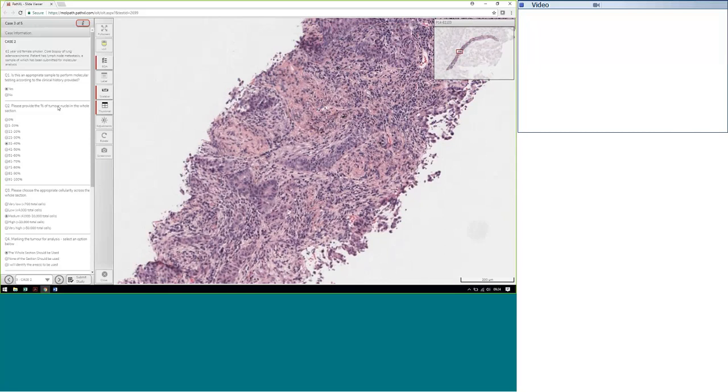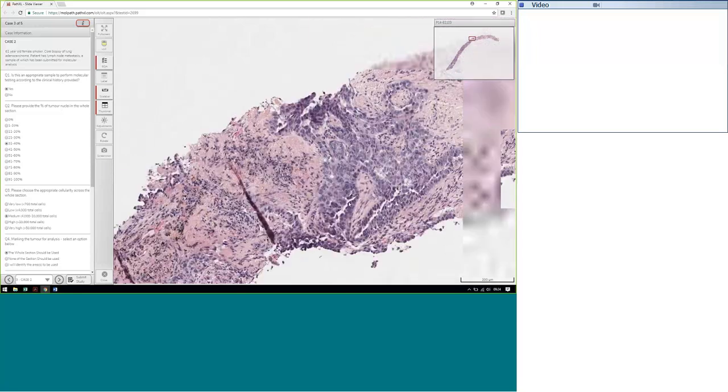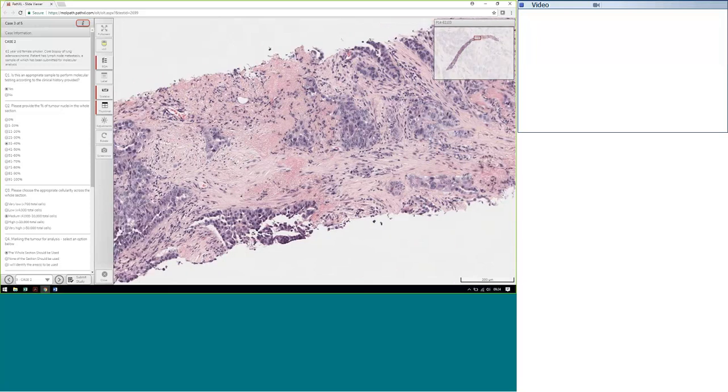Jane? Sorry, Perry. Yes, I agree with everything you say, possibly chopping off the ends with the lymphocytic infiltrate, the lymph node that's remaining would help to keep the cellularity up, and the tumour content would be more medium than low then. And again, the resulting cellularity would be medium, similar to the previous case where we have large cells scattered throughout, no matter where we're putting that. So far again for the 10 by 5 micrometer sections.